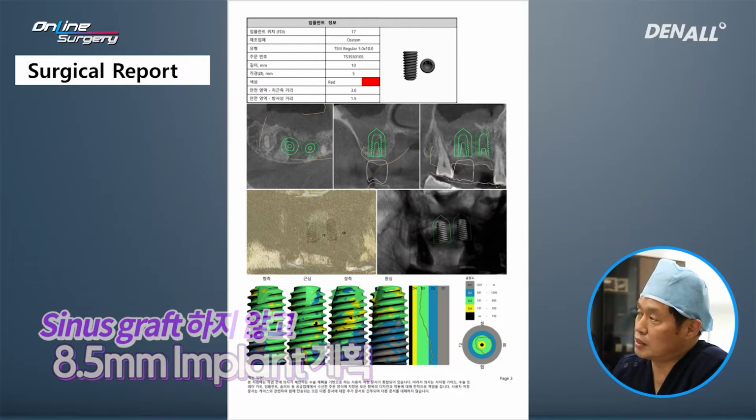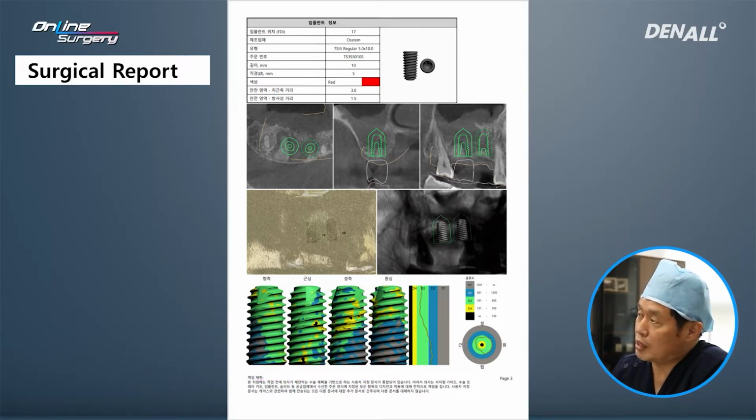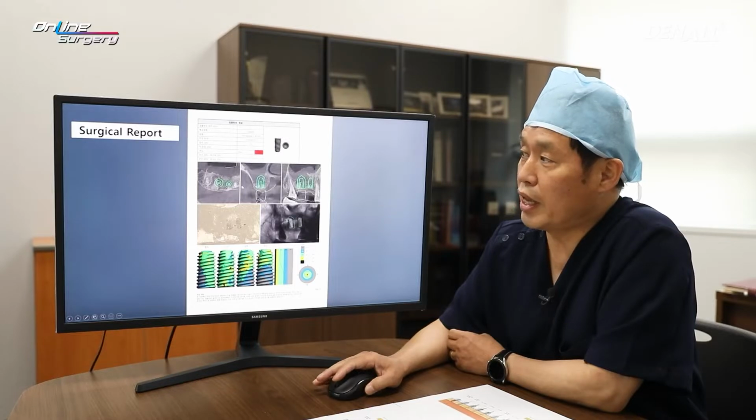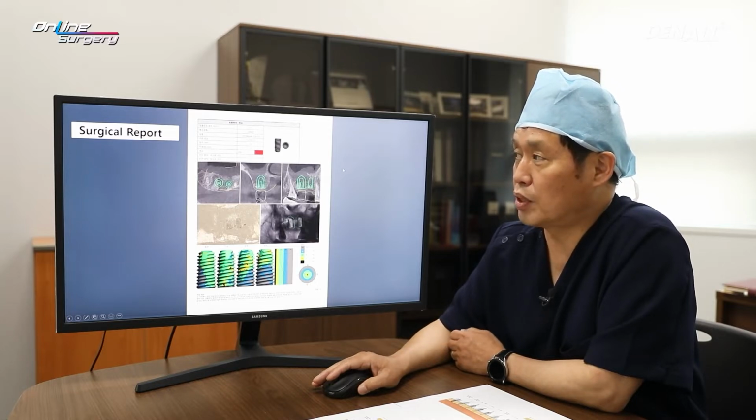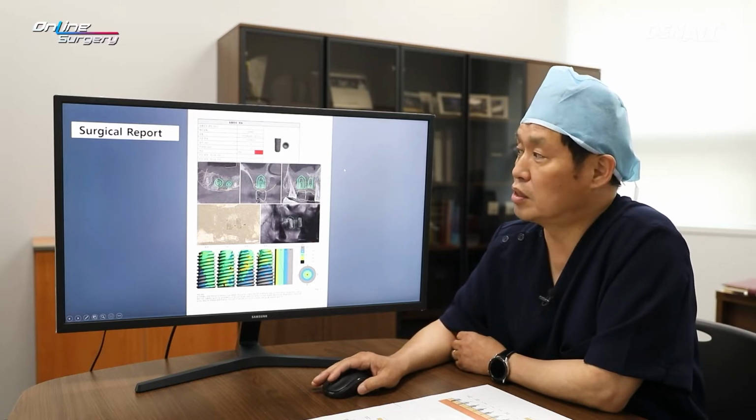As mentioned earlier, in the past, there was socket preservation and bone graft was done. Bone graft material can be seen in the posterior area. The bone seems to be harder because xenograft was used. In order to prepare for sinus floor penetration, the OneCAS drill was determined to be used for the surgery. In the posterior area, I decided on 8.5 to avoid sinus bone graft.